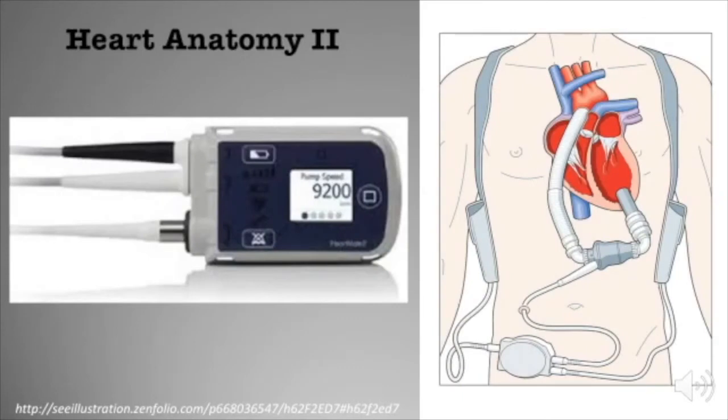Now let's zoom out and take a little more comprehensive view of the LVAD device. You'll note the prior portions of the device we spoke of earlier. Plus now you can see this line here called the drive line. This is the main power source that connects to the pump that makes it go. This is partially tunneled under the skin, and then if you follow the line, you can see where it comes out and then becomes external to the body, where it plugs into the main controller.